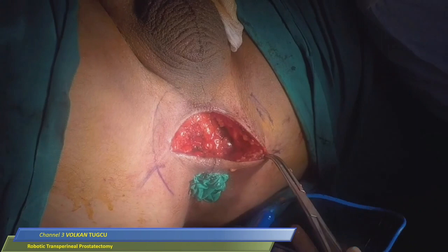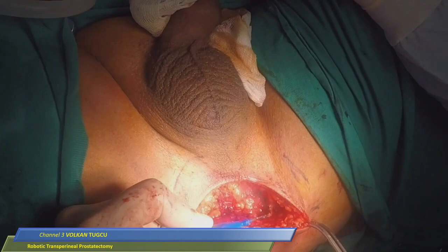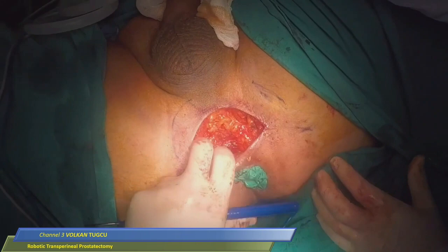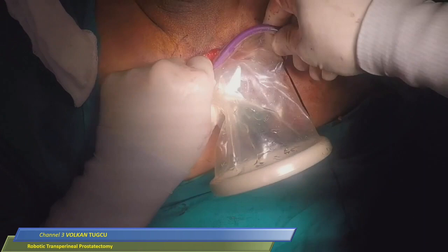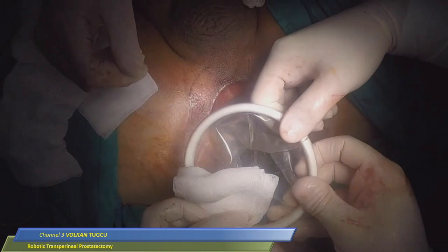So you are developing the space below the skin to put the gel port. You take time to do that. What is your main time, the normal operating time for this procedure? Yes, the open surgery is maybe 30 minutes. 30 minutes, okay. But console time is approximately one hour. Really. Ah, it's not too long. Not too long. You will see.